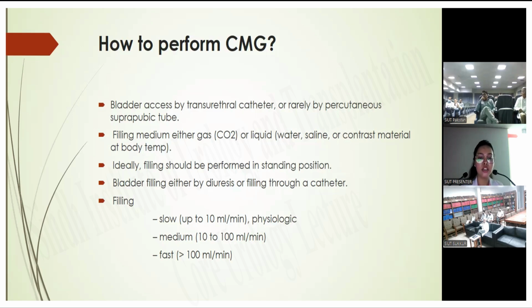There are 3 types of filling rates: slow, medium, and fast. The physiological rate is slow, which is up to 10 ml per minute, while the medium rate is 10 to 100 ml per minute, which we usually use. Fast is more than 100 ml per minute.